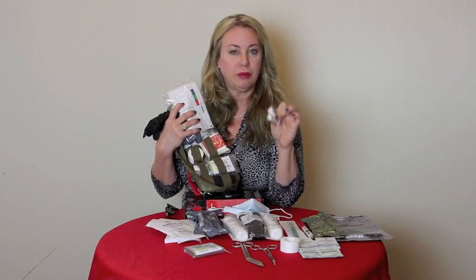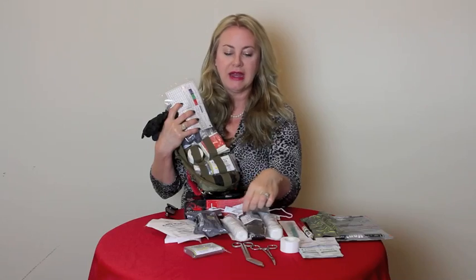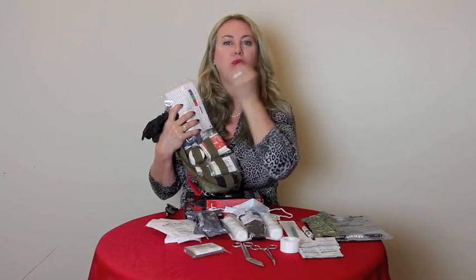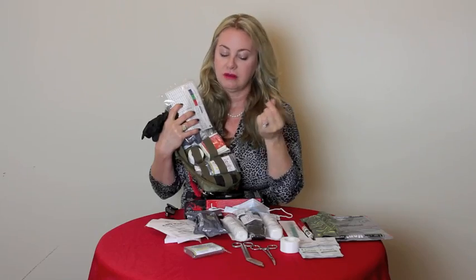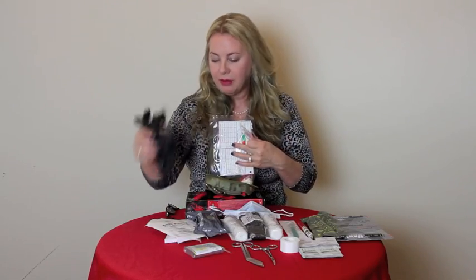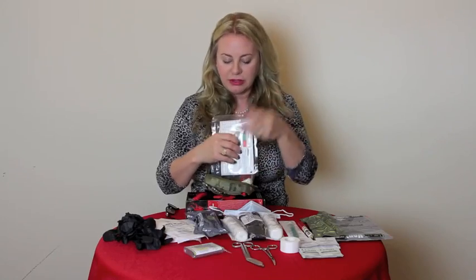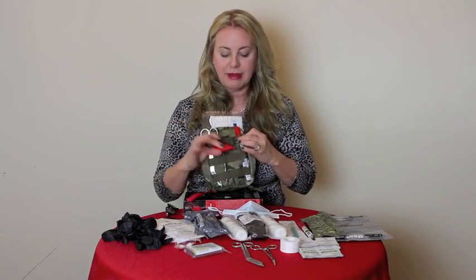There is a horrible stench that emits from these little ampules, and what you would do is just quickly whiff it underneath the patient's nose. Maybe they'll wake up. Obviously, this is for someone who's breathing. If you come upon somebody who's not breathing, you're going to be doing CPR. And that's what the CPR mask is good for.